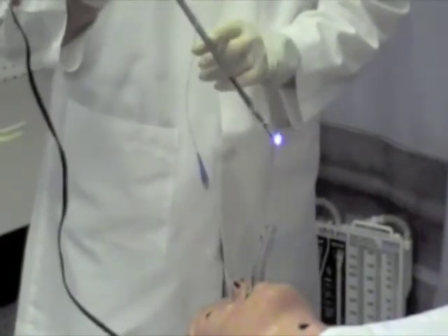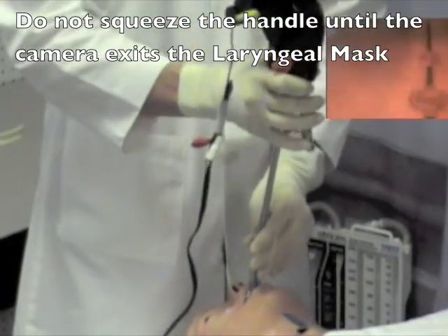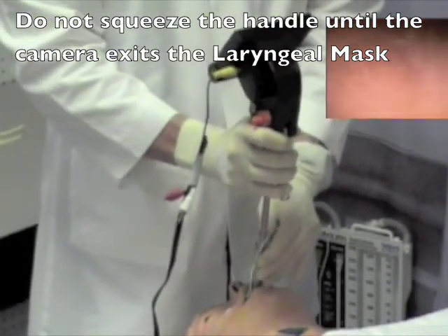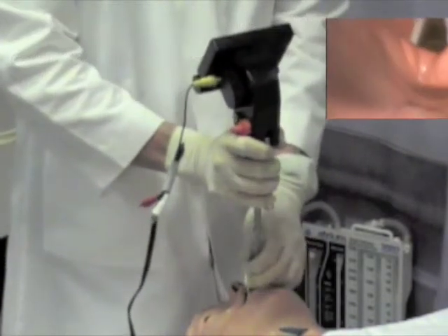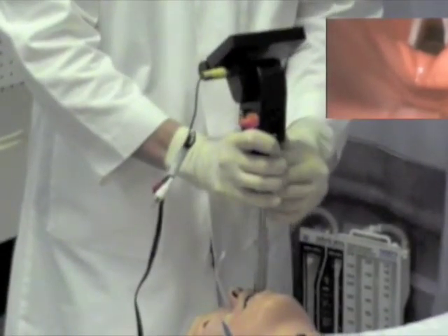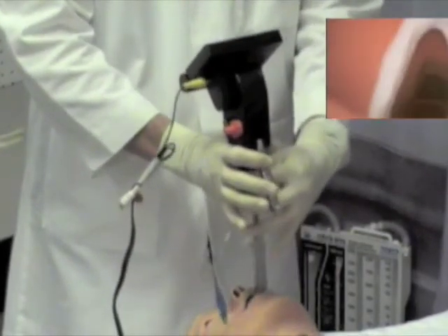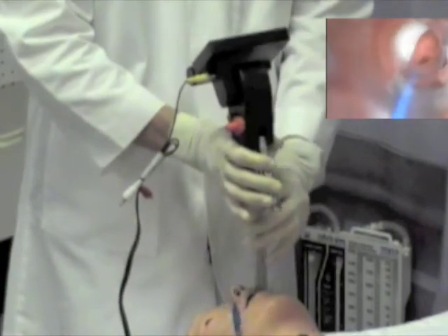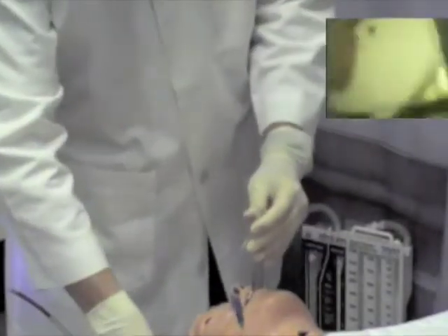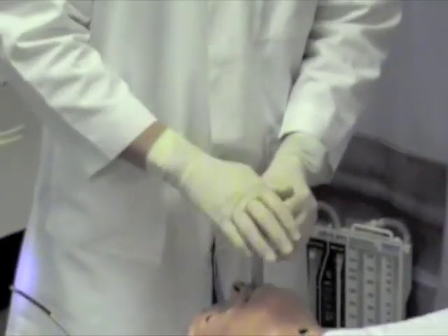The video rifle and the tracheal tube is then inserted through the supraglottic device and slowly advanced. When you reach the bowl of the supraglottic device, the handle is gently depressed to appropriately align the device through the vocal cords. The endotracheal tube can then be advanced through the vocal cords and the patient is intubated. The video rifle is then removed, the cuff on the endotracheal tube inflated, and the patient ventilated.